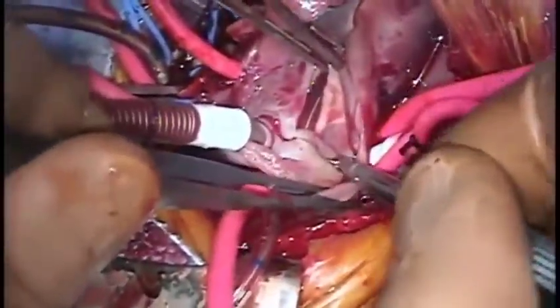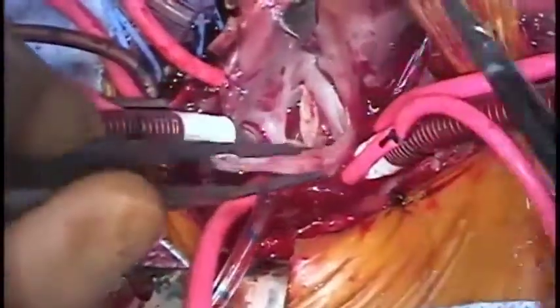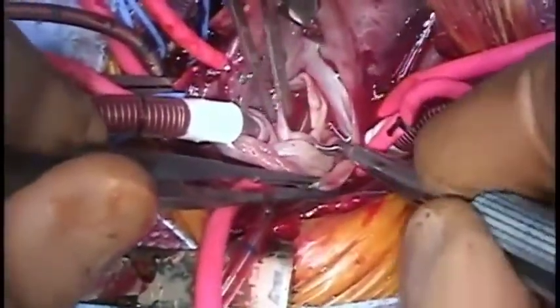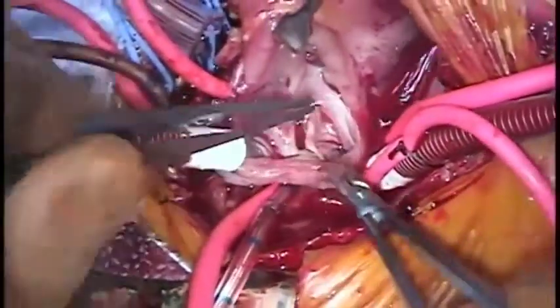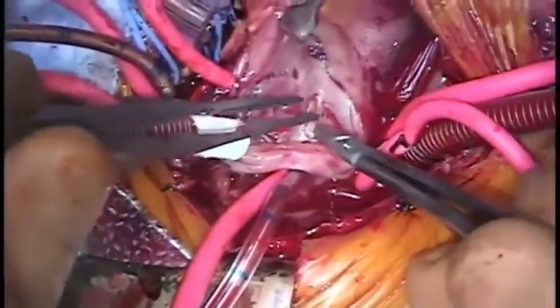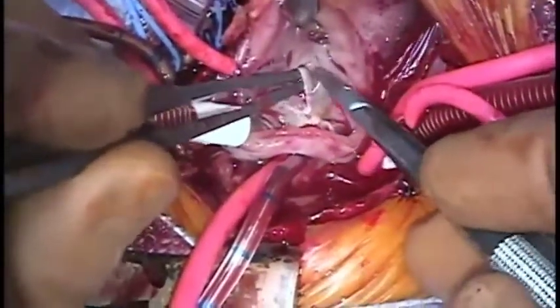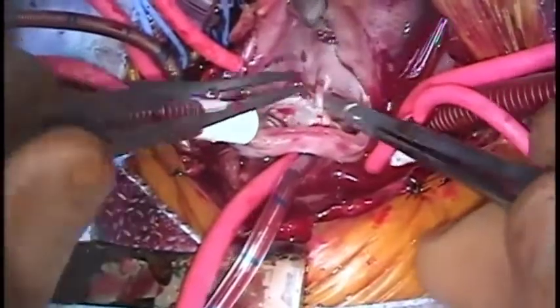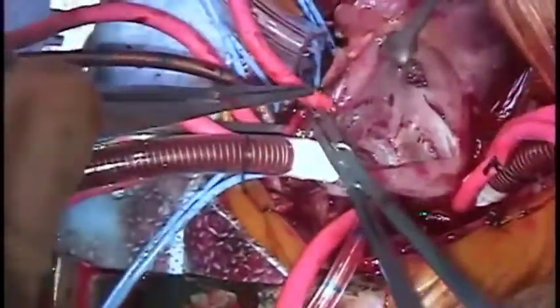Next, the atrial septal defect is closed by continuous suture. A small fenestration of around 4 mm in diameter is left superiorly. Here you can see the tail of the suture being brought up as a second layer. Two ends of the suture are then tied together.